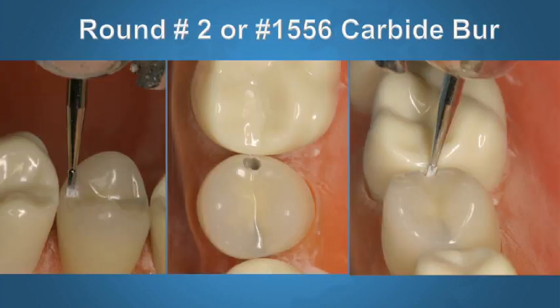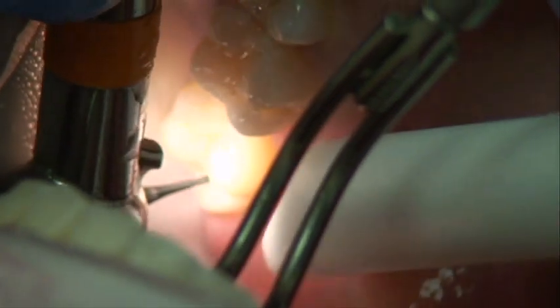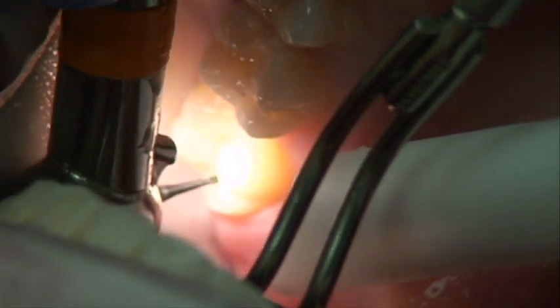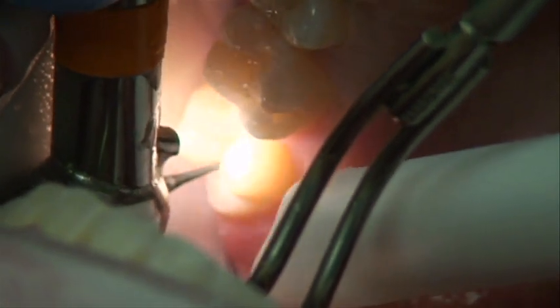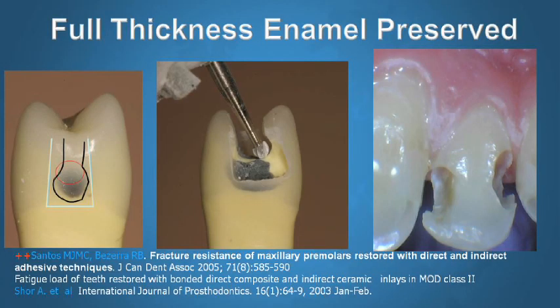Smaller instruments are also desirable. The bigger drills lead to more and more excessive, unnecessary removal of tooth. Right there you see me with a 333, which is a pear-shaped bur, and the preparation, as we talked about, is minimally invasive. We are going to use magnification as much as possible, and good illumination. We don't want to forget that the day of the geometric preparation is gone.